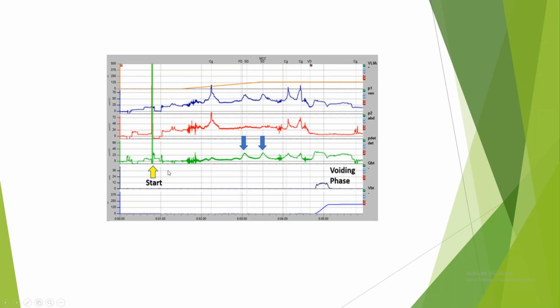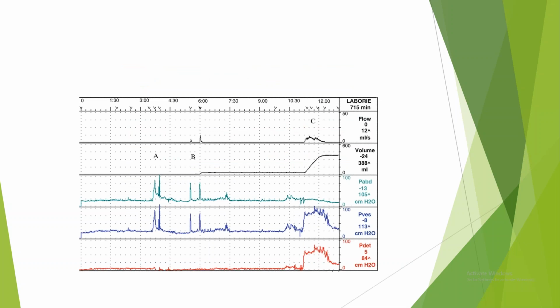No, this is not a leak. This is the graph from the top. This is the start of the study. They have first set it to 0, and here they have started the filling phase. Here they have started the proper graph. They will write the leak properly, they will write LEAK. Otherwise, they will give some changes in the flow. So a leak, you will know it is a leak. That is the only thing you have to look for. See now this.